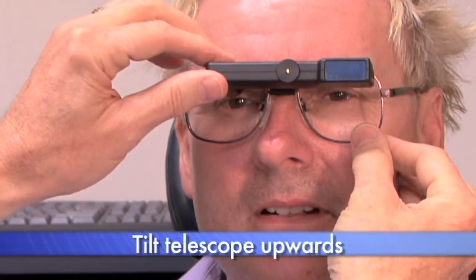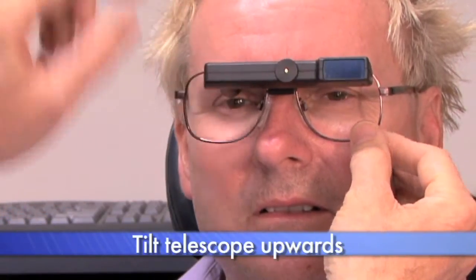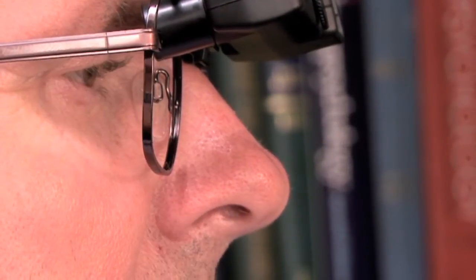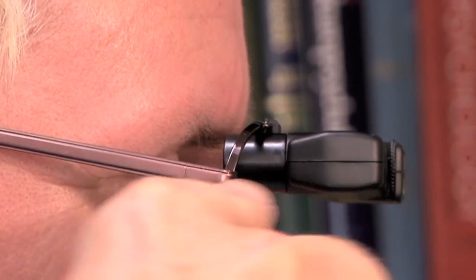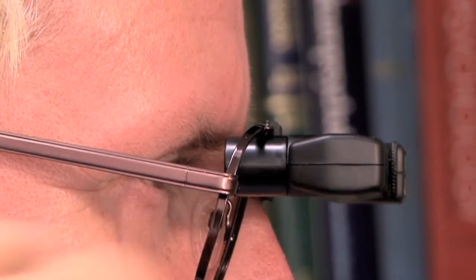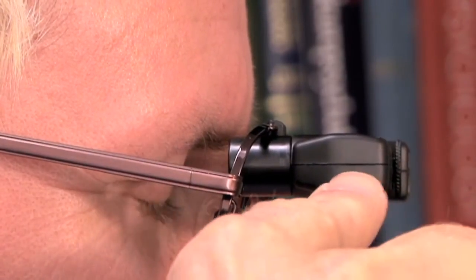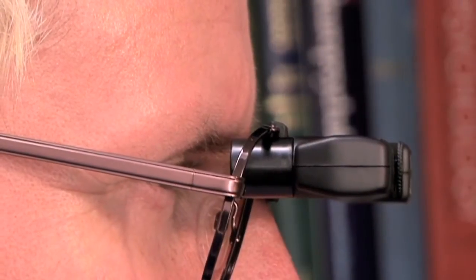Step three, increase the angle of the front of the telescope — you can flip it down or flip it up. When adjusting the angle of inclination, make certain that when the patient dips their head down to sight through the telescope, there's a straight line going through the telescope into the eye. The mold has a line right across the side of the telescope you can use as a guide. Otherwise, you may get vignetting or loss of some of the field of view.